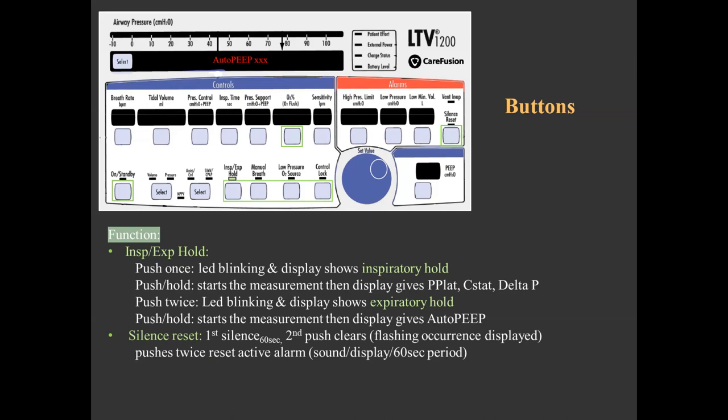Note that inspiratory hold cannot be performed on a pressure breath. The silence/reset function button manages alarms. When an alarm occurs, a flashing alarm message and flashing associated control display appear along with an alarm sound. To silence an active alarm, push the alarm reset once — the audible alarm is silenced for 60 seconds only, but the flashing display continues. To clear an inactive alarm, push silence/reset again. To cancel an active alarm, push silence/reset twice, which clears both audible and visual alarms and terminates the silence period. This button can also be used preemptively to silence an alarm for 60 seconds or to silence an inoperable ventilator.